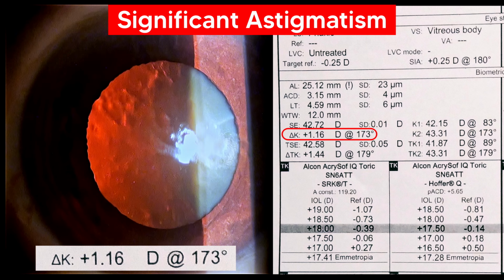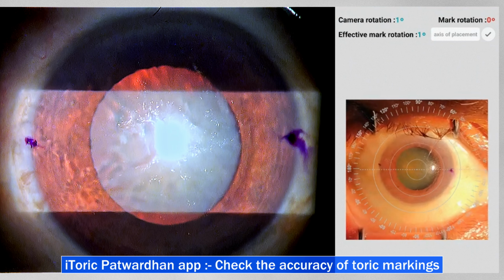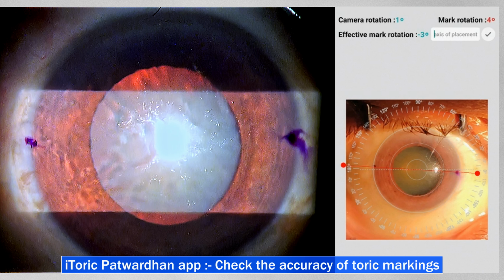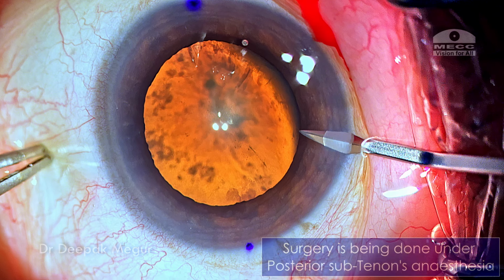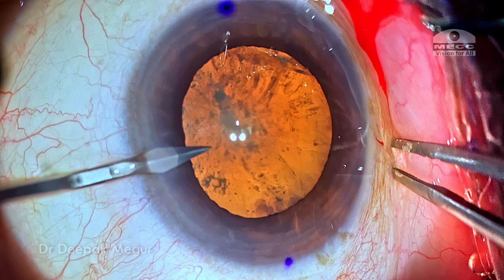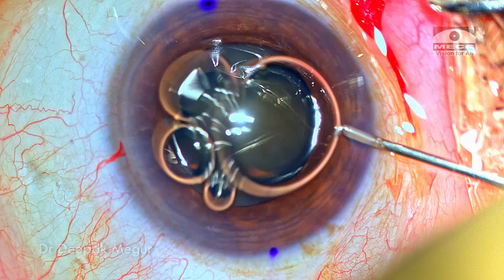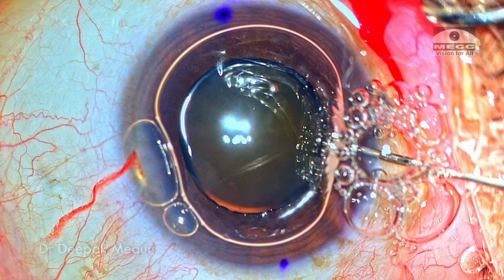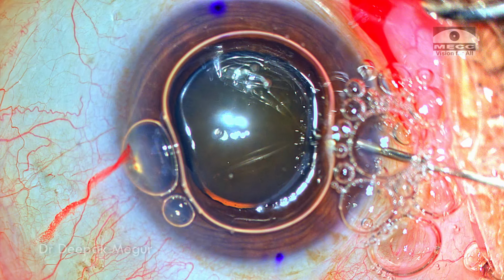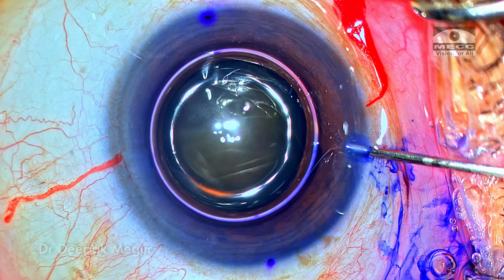The patient had significant astigmatism as well, so I'm planning a toric lens. In this patient, the markings are done and the lens is supposed to be aligned at 178 degrees, and that's what I'm doing now. The plan is to have an adequately sized rhexis. I'm planning a slightly bigger rhexis in this patient. This is to ensure that the nuclear fragments can be pulled out of the bag and I don't have to work very deep, which is a common thing we encounter when we don't have the vitreous jelly behind it.